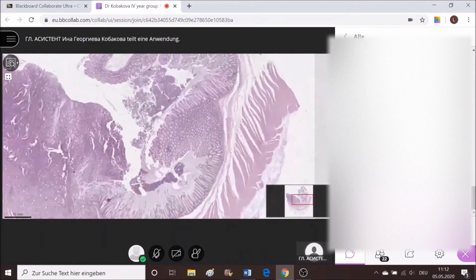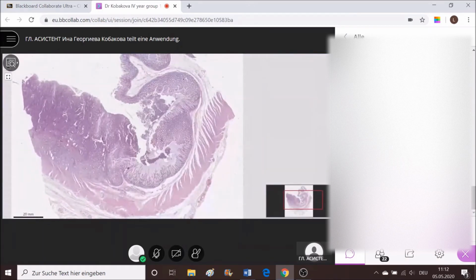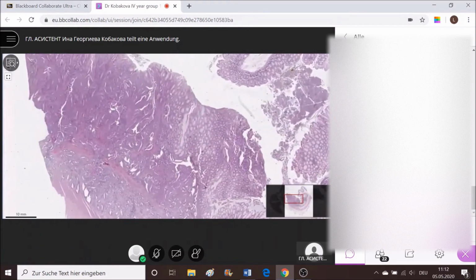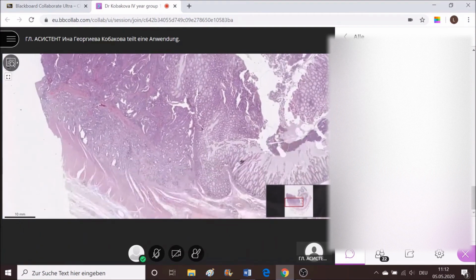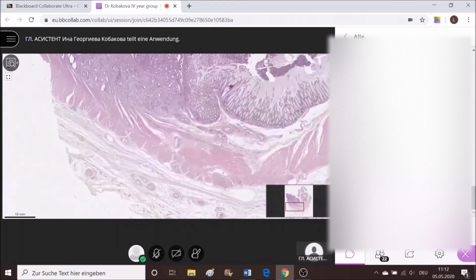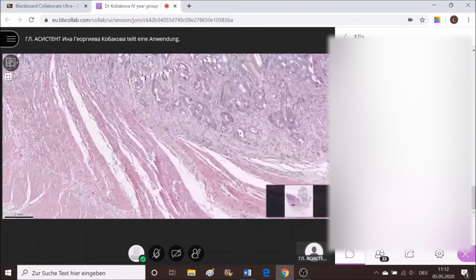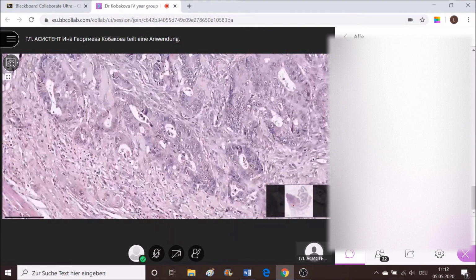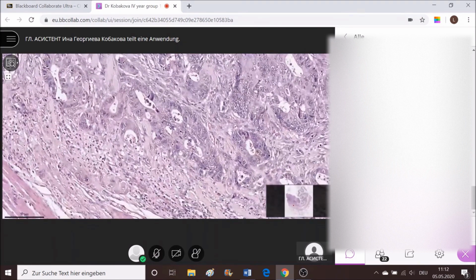So we marked the field which is normal, we marked the field which is tumorous, and we marked where it's spreading to in the muscle layer, up to it, not going further. We should take a look at this field closer. Now, remembering the cells, take a look at the nucleoli on the inside.